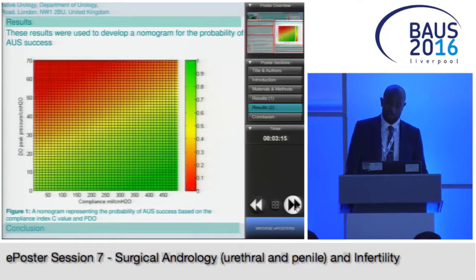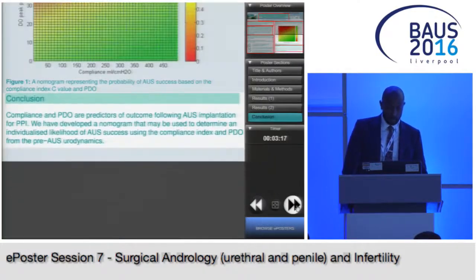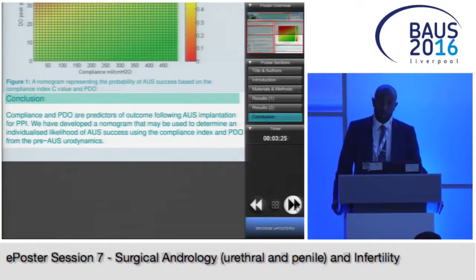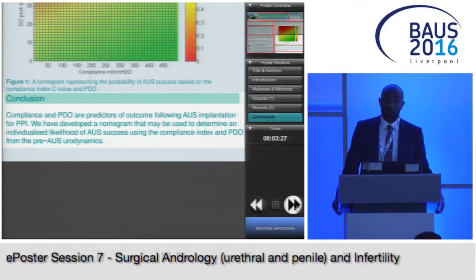So in conclusion, compliance and detrusor overactivity, especially the peak pressure, are predictors of AUS success. And what we've derived is essentially a nomogram that allows you to use it as a counseling tool and derive an individualized probability of success post-AUS implantation to treat post-prostatectomy incontinence. Thank you.